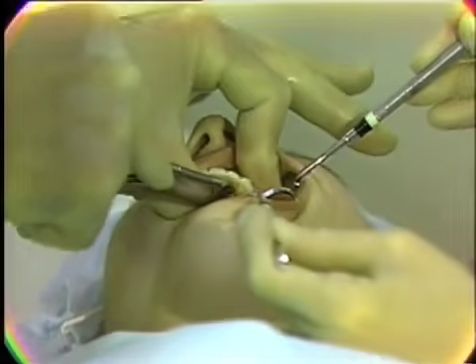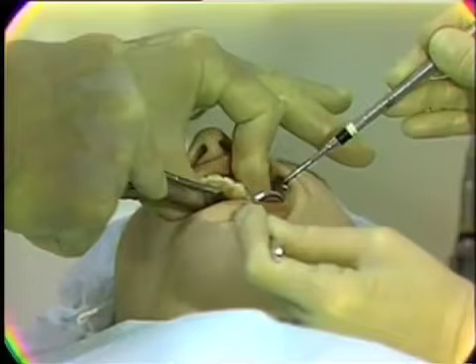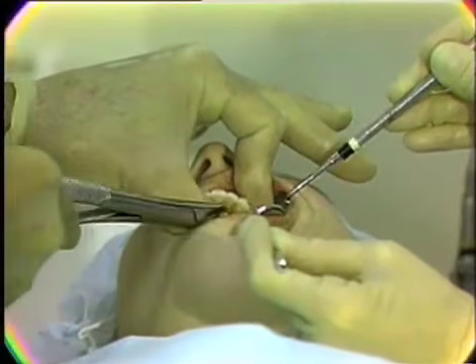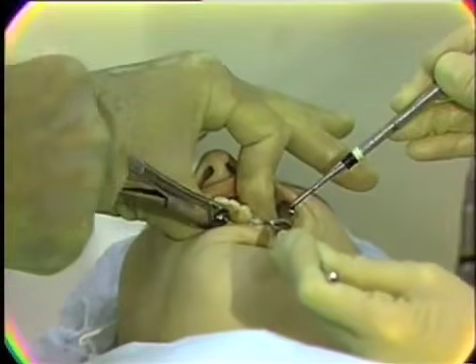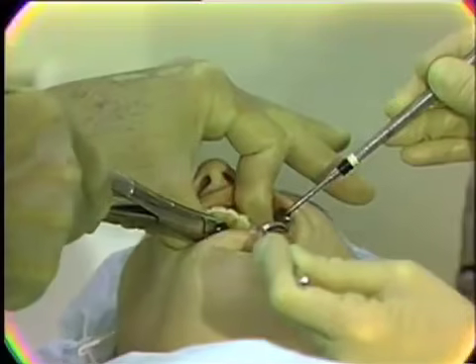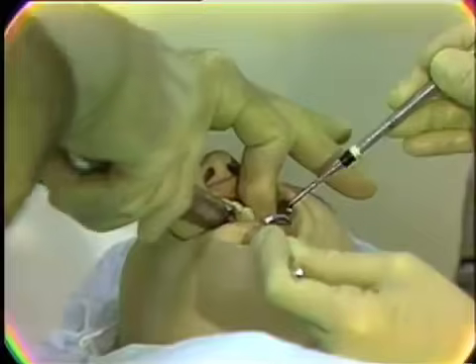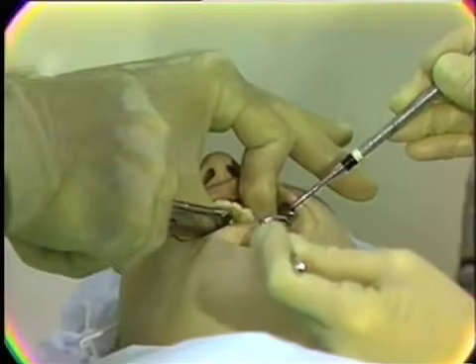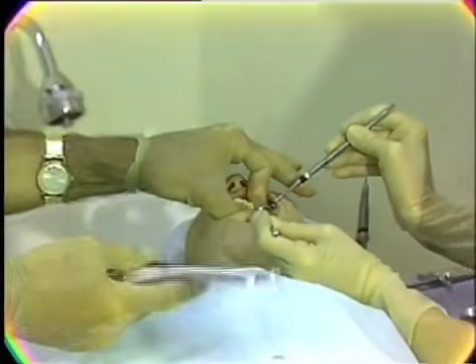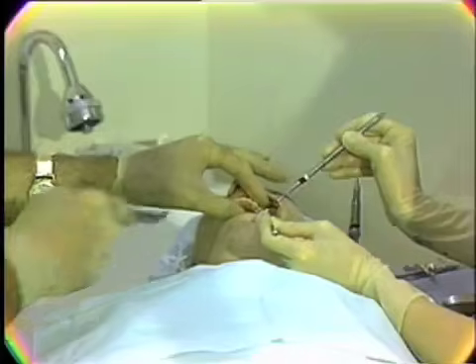The tooth is never pulled, or there is never any traction exerted until complete mobility has been obtained. As a matter of fact, when the first pressures are used, there is actually a force toward the apex rather than any traction exerted on the tooth. Once mobilized, again the same sequence of muscle groups beginning with the forearm and winding up with the wrist, so that the final delivery of the tooth is a gentle one and not one that is sudden or violent.